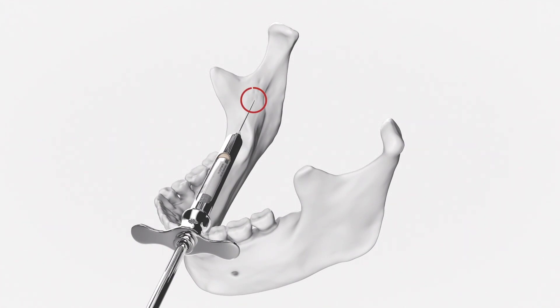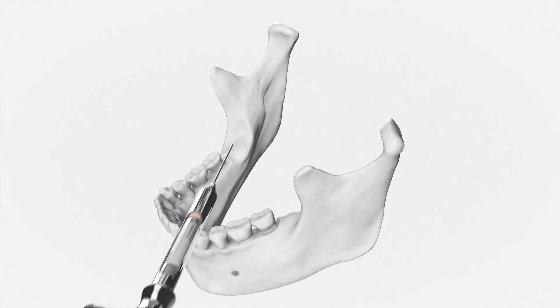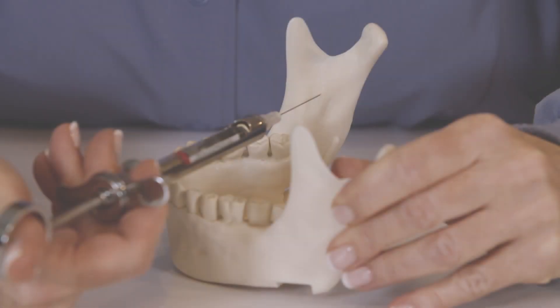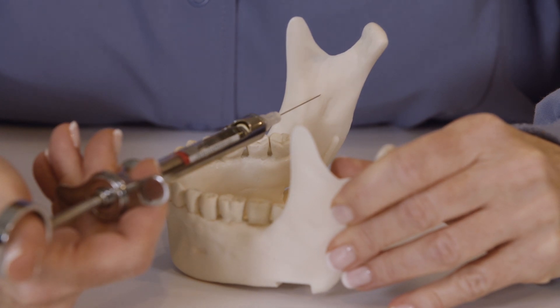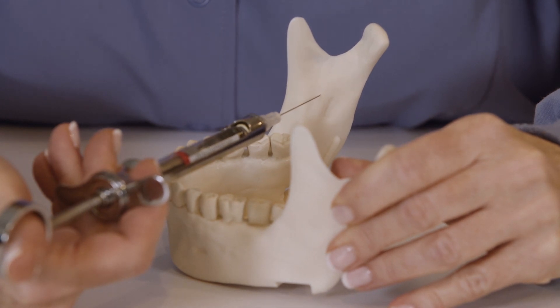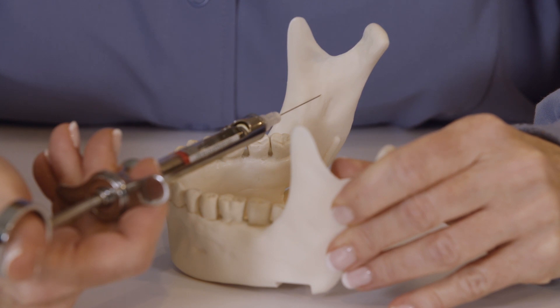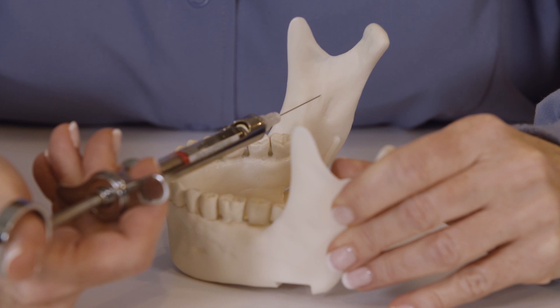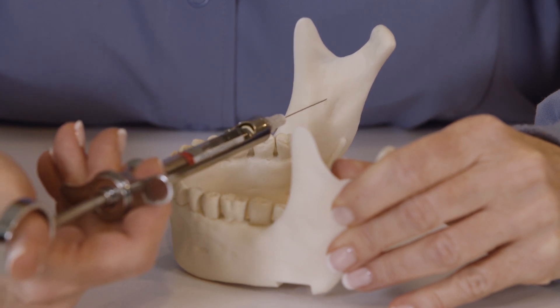The injection site is usually six to ten millimeters above the occlusal plane. The barrel will be oriented contralaterally, starting at the second premolar area, with the syringe held parallel to the mandibular occlusal plane and at the level of the coronoid notch. The needle will be in a plane that intersects the mandibular sulcus.